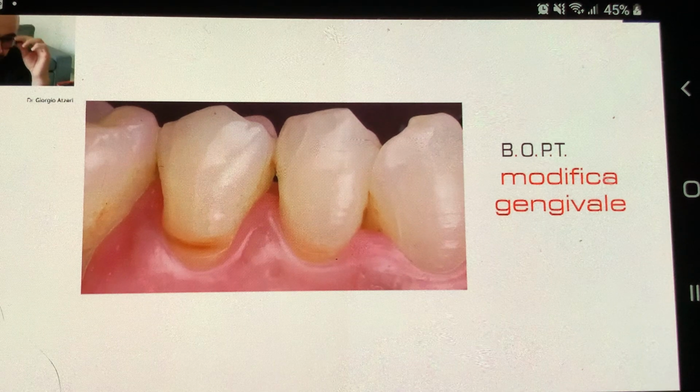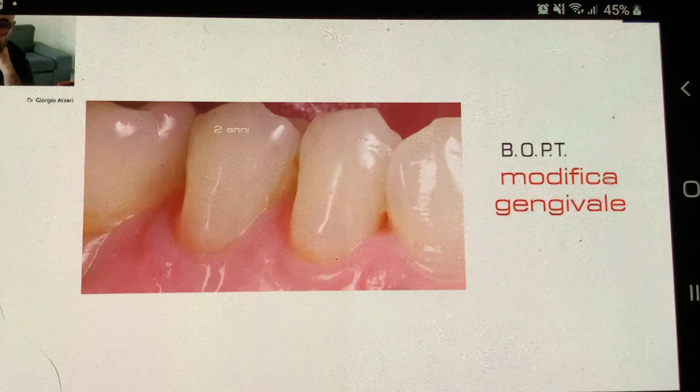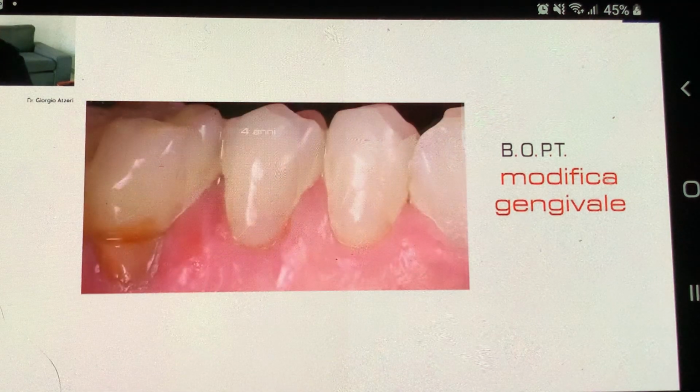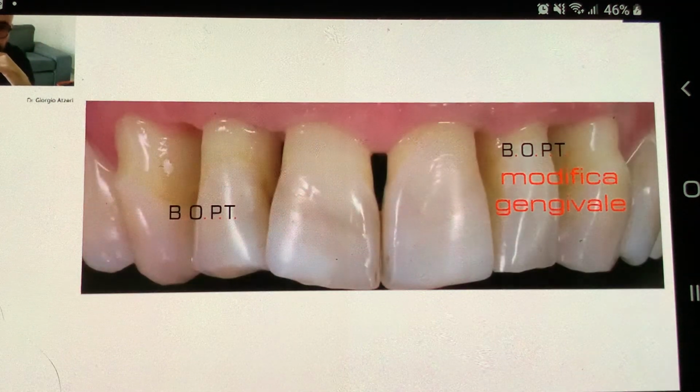Through a change in the shape and of the gingival profile, like in this case, we can induce a slight improvement of gingival trophism, therefore a volume change, which will be useful when the patient, after some years, will no longer be able to clean. Like, for example, here, this is a patient that is hospitalized, so it's difficult for these patients to clean the teeth, but will not have a recurrence. And the same goes for veneers.